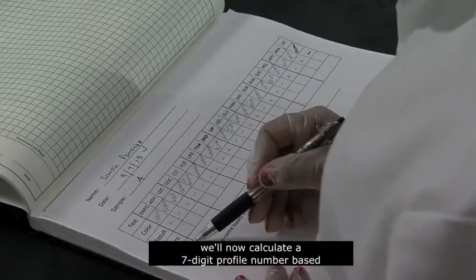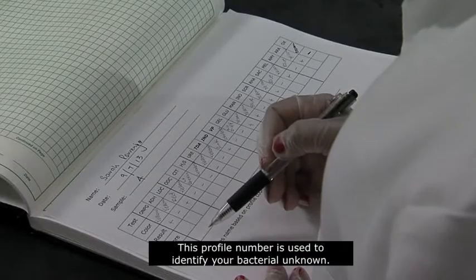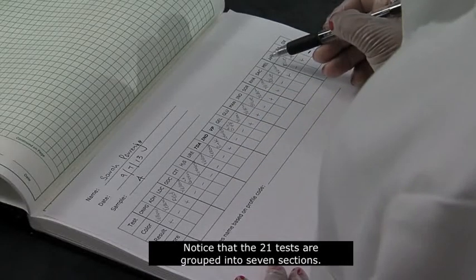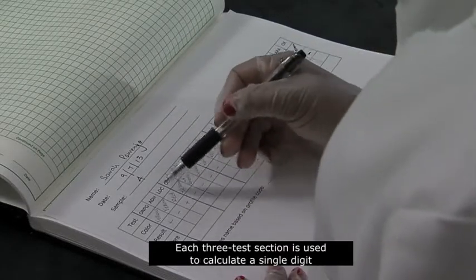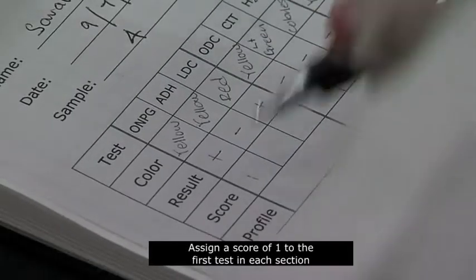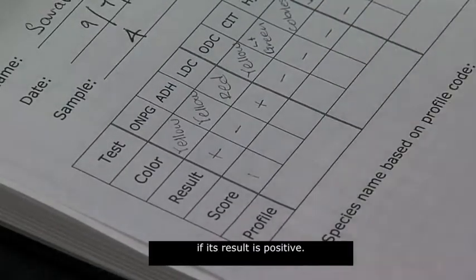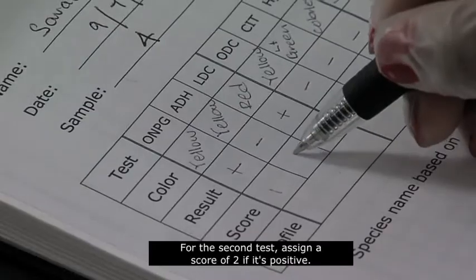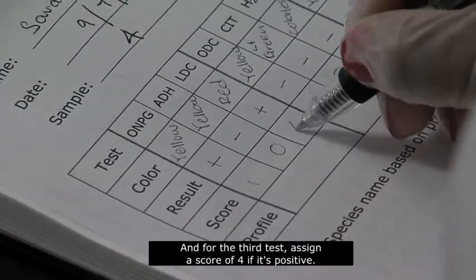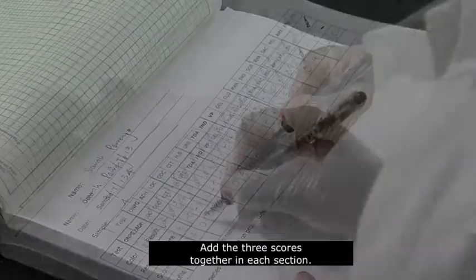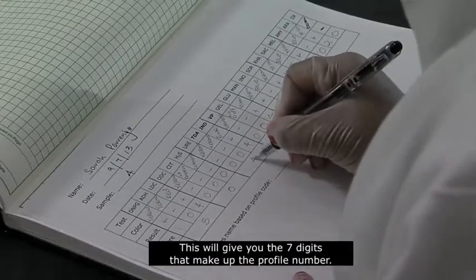With all the test results recorded, we'll now calculate a seven-digit profile number based on those results. This profile number is used to identify your bacterial unknown. Notice that the 21 tests are grouped into seven sections. Each three-test section is used to calculate a single digit of the profile number. Assign a score of 1 to the first test in each section if its result is positive. Otherwise, assign a 0. For the second test, assign a score of 2 if it's positive. And for the third test, assign a score of 4 if it's positive. Add the three scores together in each section. This will give you the seven digits that make up the profile number.